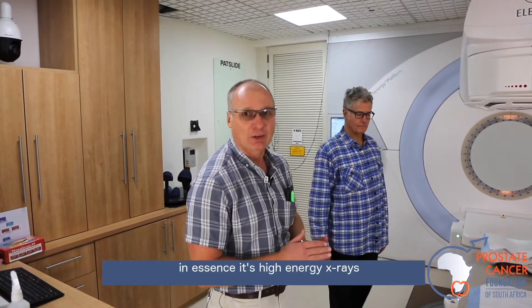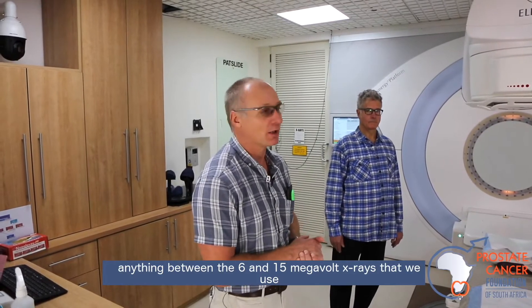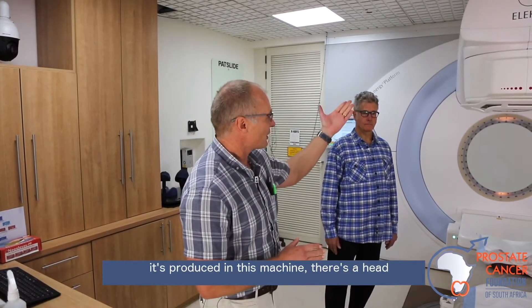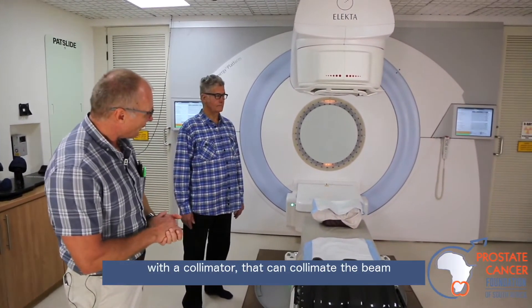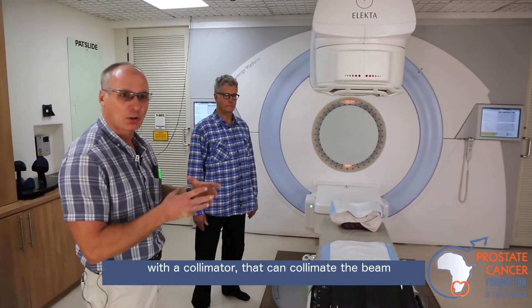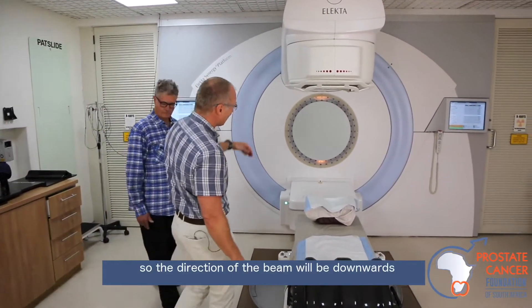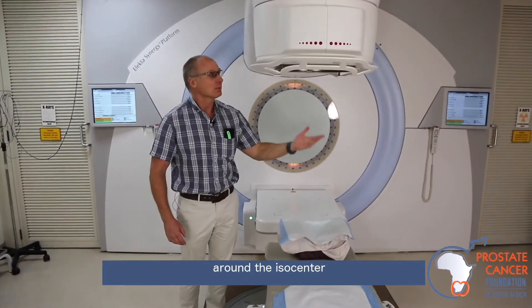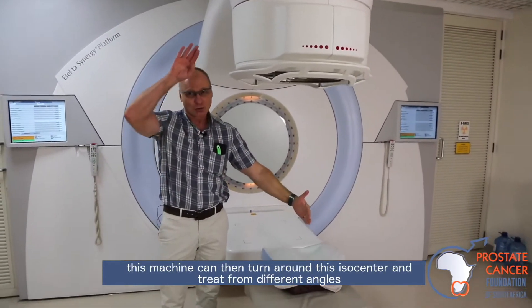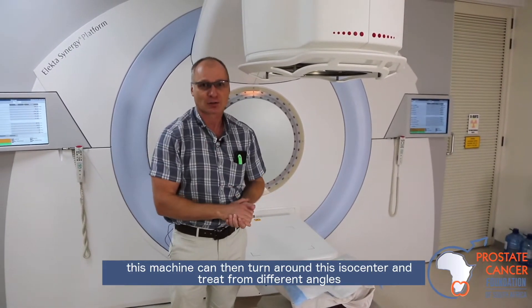In essence, it's high energy X-rays — anything between 6 and 15 megavolt X-rays that we use. That's produced in this machine. There's a head with a collimator that can collimate the beam as it exits the machine, directing the beam downwards around the isocenter. This machine can then turn around this isocenter and treat from different angles.